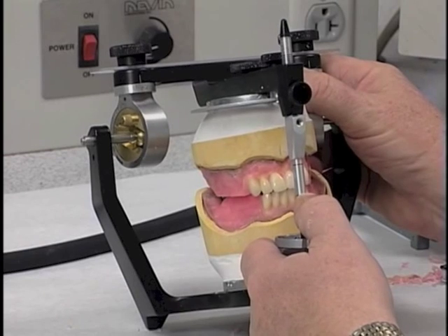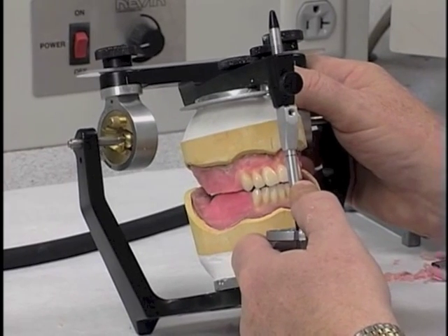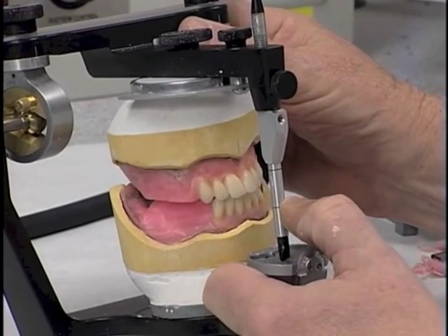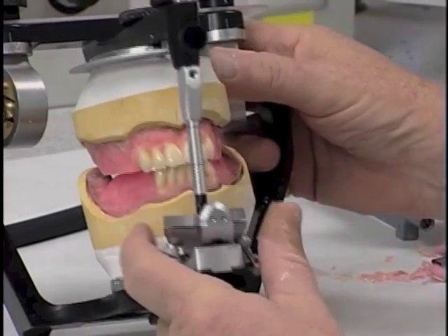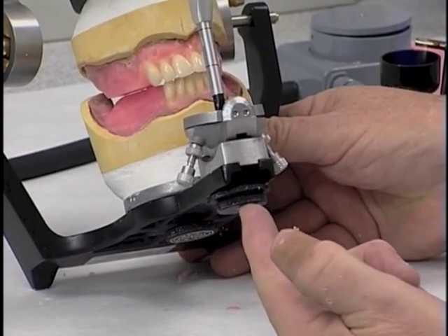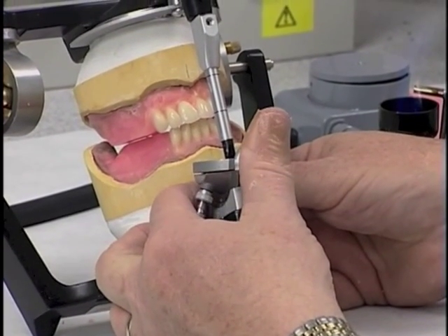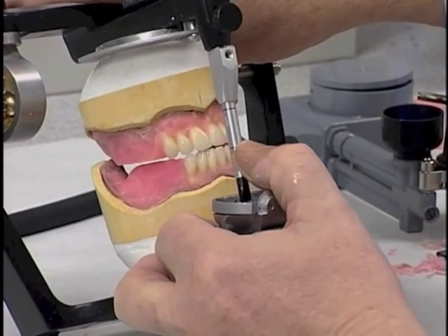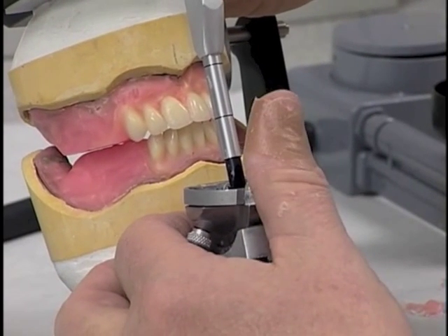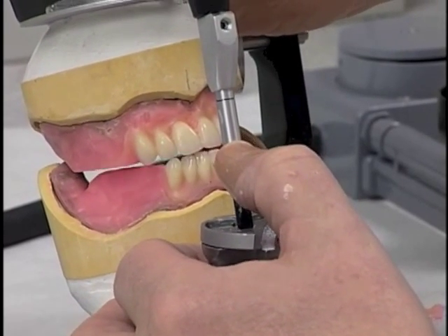And let's move the teeth into a straight protrusive, and we see that basically that canine is interfering on that left side when we do that. So in other words, this incisal guide table, as we do that, it has a jump to it. So what we can do is we can raise the incisal guide table by unscrewing that bottom knob at the base of the articulator and then rocking this incisal guide table in such a way that that canine now is just barely hitting high now, so we can raise it a little more if we want to. There we go. And it's just barely grazing it now.